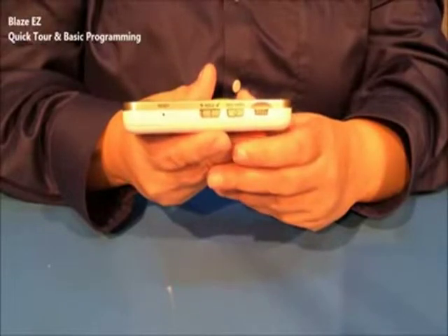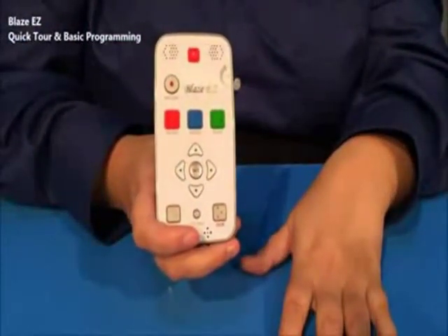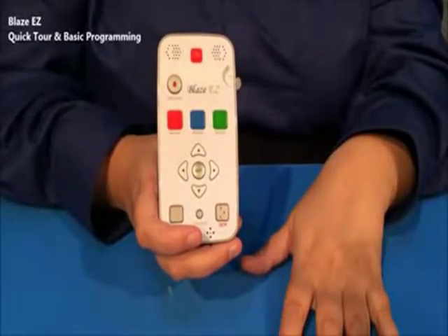So that is a basic orientation to the unit. These are all of the buttons and ports that you need to know to operate everything. So now let's take a look at how it works.